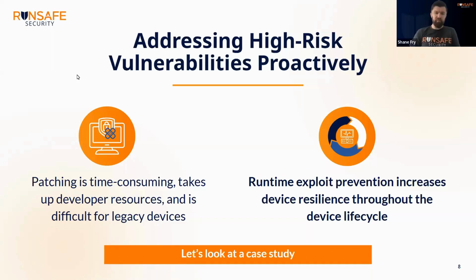Yeah, I mean, it varies wildly, to be honest. There are some device manufacturers that are doing everything they can to not push software out, and minimize criticality and things like that. And in some cases that's warranted, right? If you need physical access to a pacemaker to attack it, if the pacemaker's in someone's body, you can probably downgrade that severity.